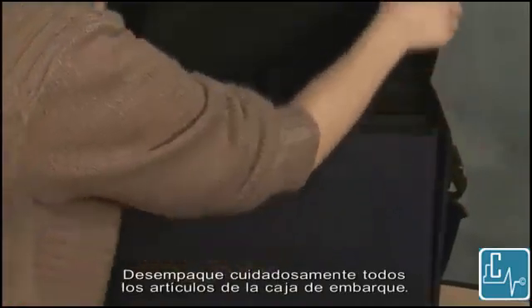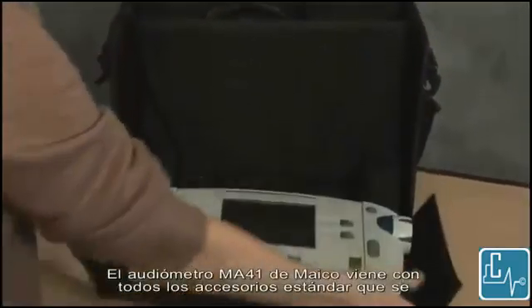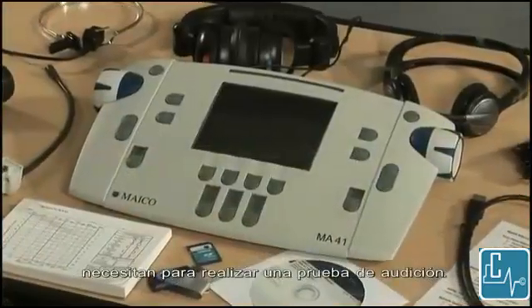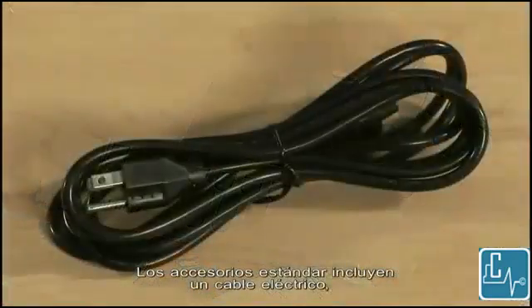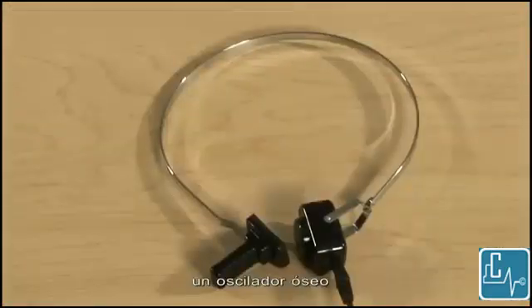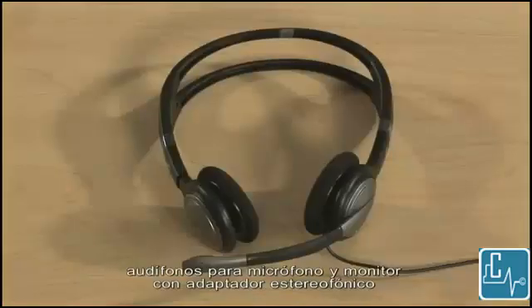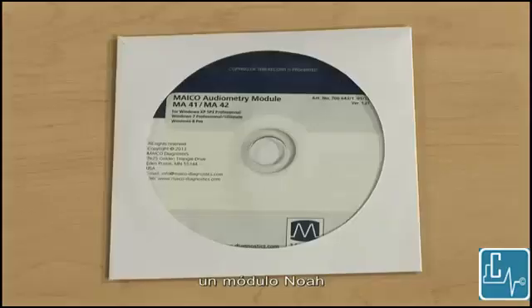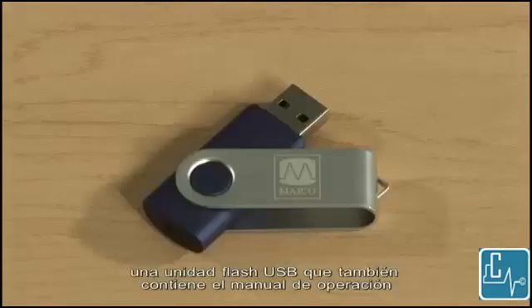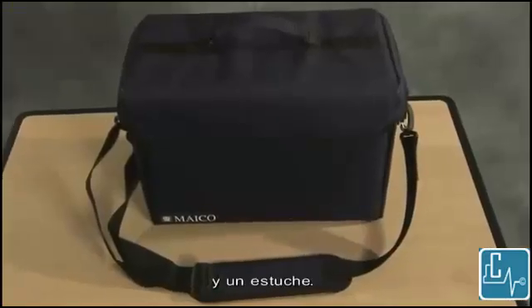Carefully unpack all items from the shipping box. The MAICO MA41 audiometer comes with all the standard accessories necessary to conduct a hearing test. Standard accessories include a power cable, headphones, a bone oscillator, a patient response switch, mic monitor headset with stereo adapter plug, SD memory card with WAV files, NOAH module, USB flash drive which also contains the operation manual, USB cable, a quick guide, and a carrying case.